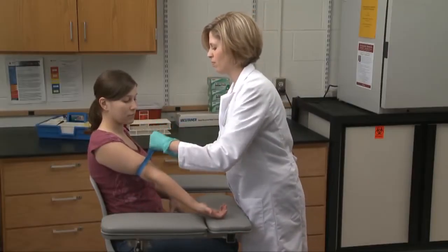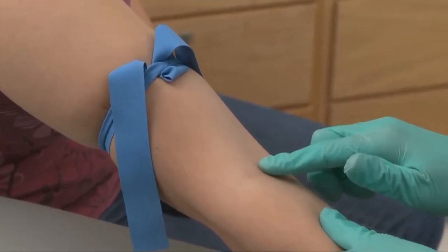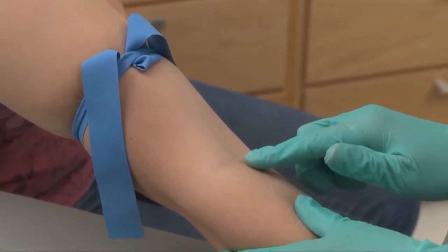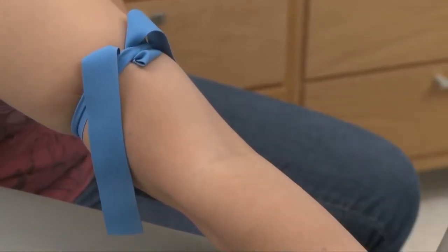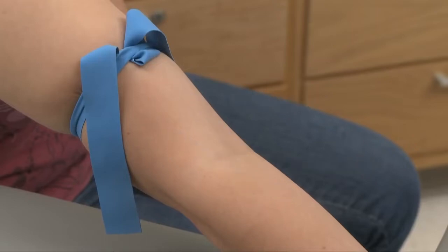Applying a tourniquet slows the flow of blood in the veins and increases venous filling, thus making the veins more prominent, easier to locate, and easier to enter. Use your fingertip to palpate the antecubital fossa to locate the median cubital vein. Palpation helps determine the direction of blood flow in the vein, to gauge the vein's size and depth, and to estimate its tendency to roll.